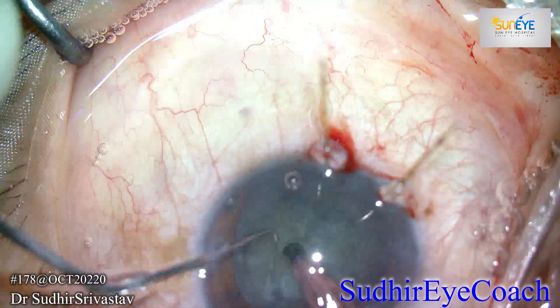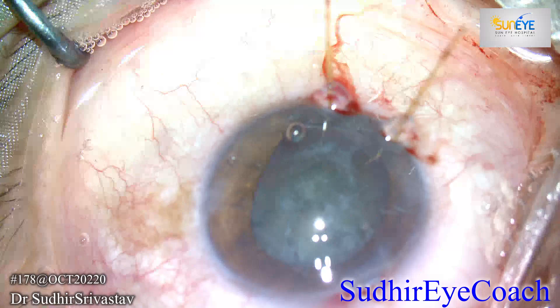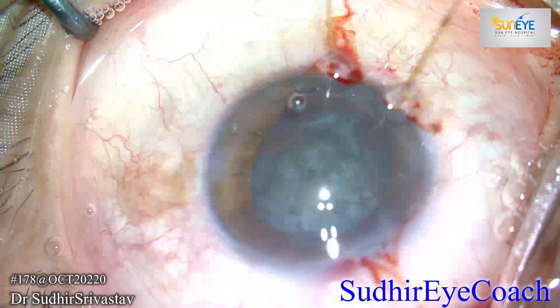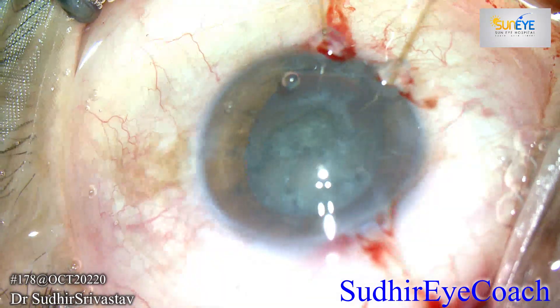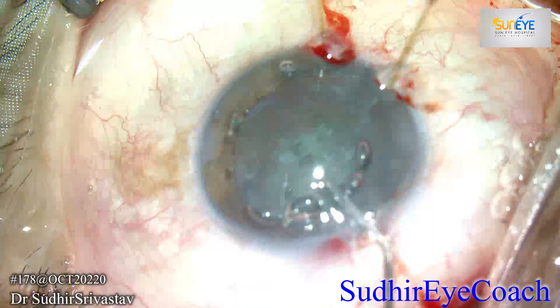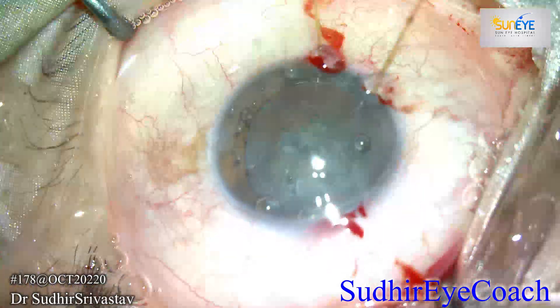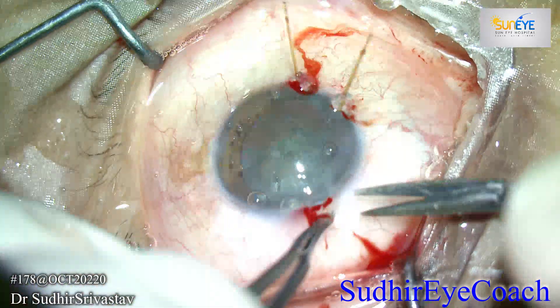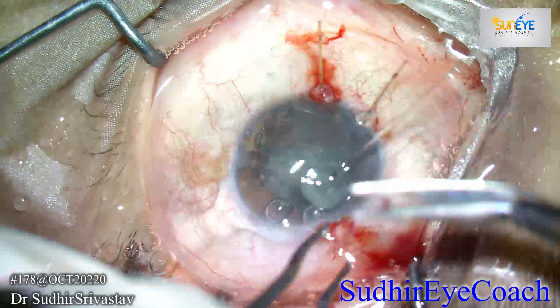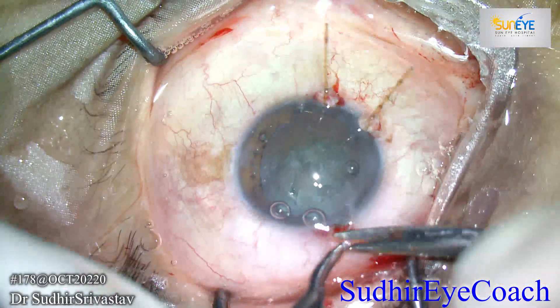Always before entering the anterior chamber, make your FACO settings suboptimal. If you are using a gravity-fed system, reduce the bottle height. If you are using an active fluid assist, reduce the intraoperative pressure. I kept intraocular pressure below 40 so that I would not create further stress on the capsular area.